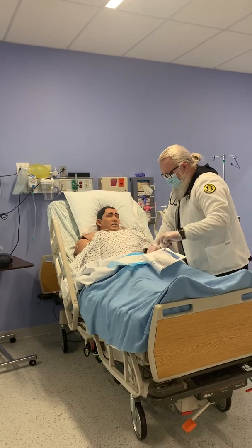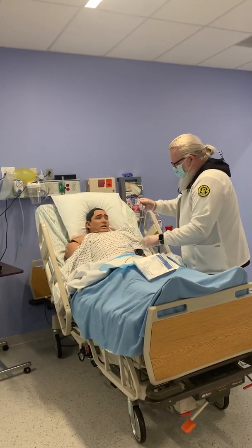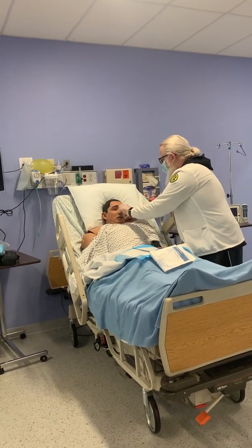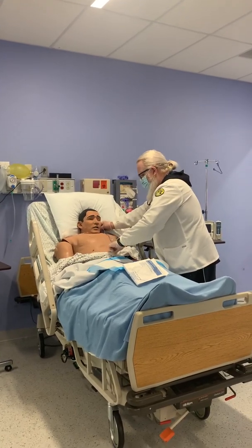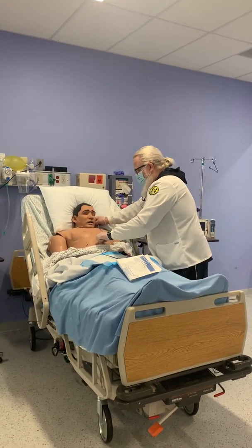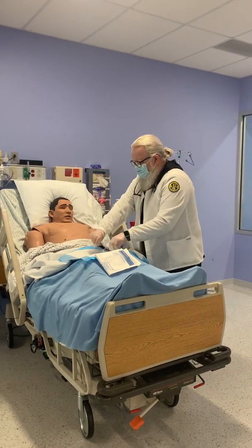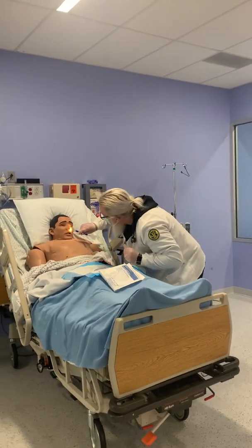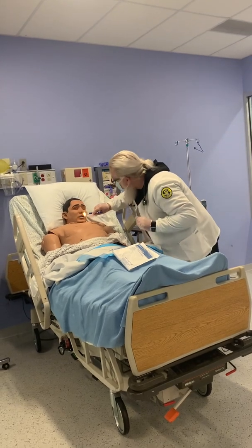I'm just going to put this right here. First thing I'm going to do is measure it, okay? The way that we do that is I'm going to measure from your nose to your earlobe. I'm going to bring your gown down, and I'm going to check the xiphoid process, okay? Now before we do that, I do want to make sure, checking up your nose, that there's no blockage, no deviated septum.